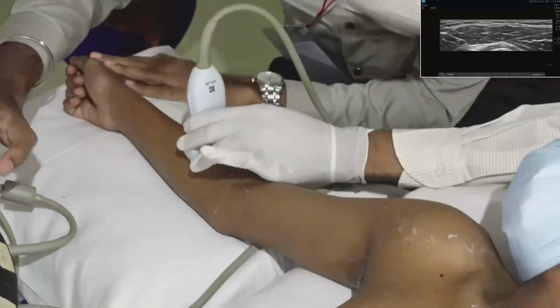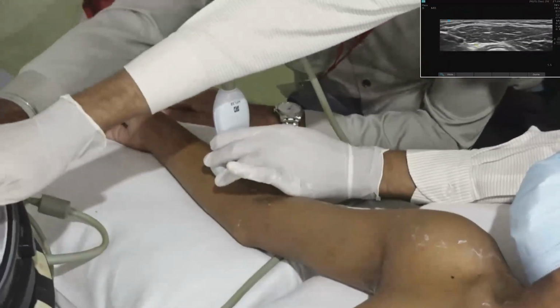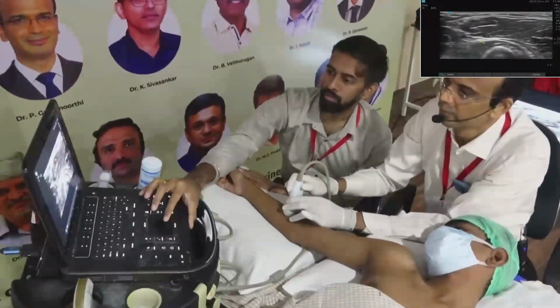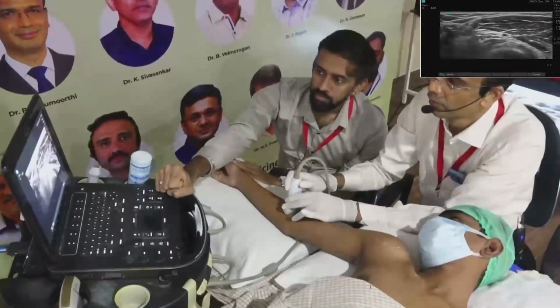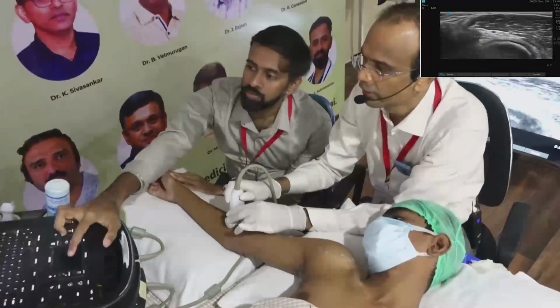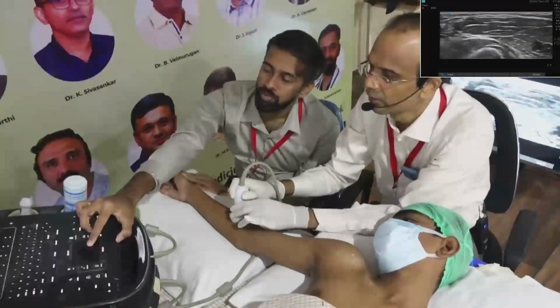This is the radial, increase depth. Okay. So this is radial now. Now you can see almost two components, it is getting divided, superficial and deep.